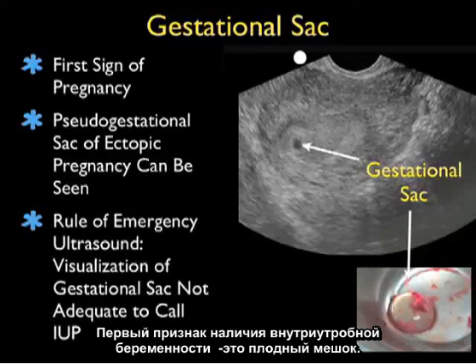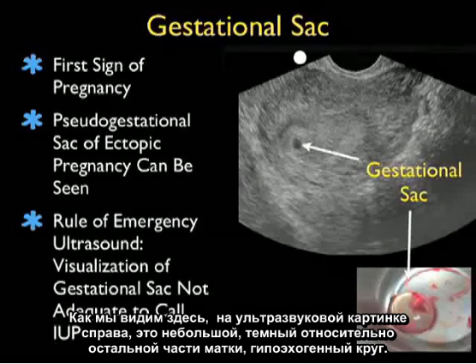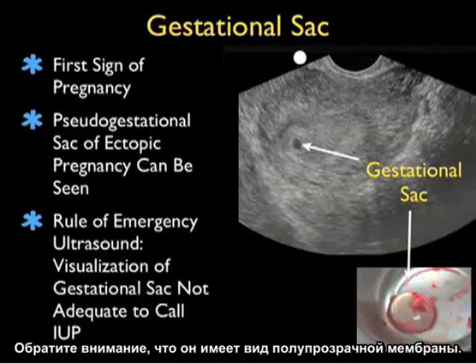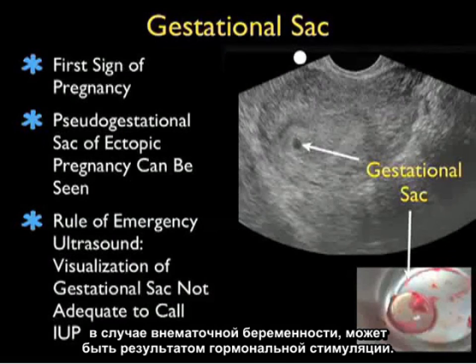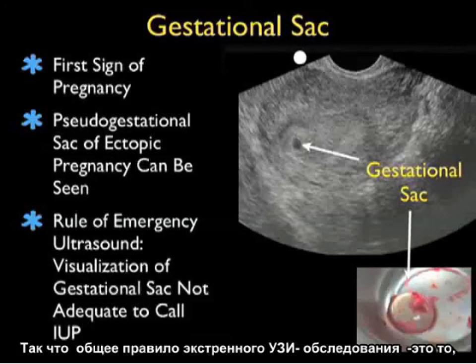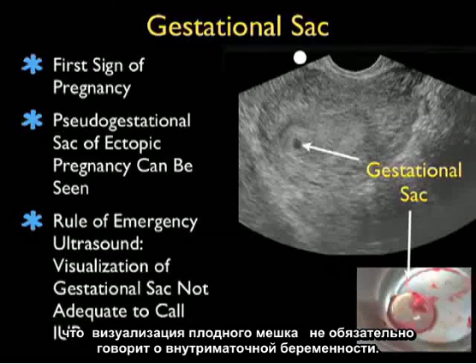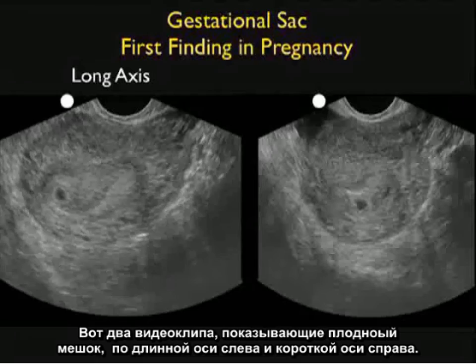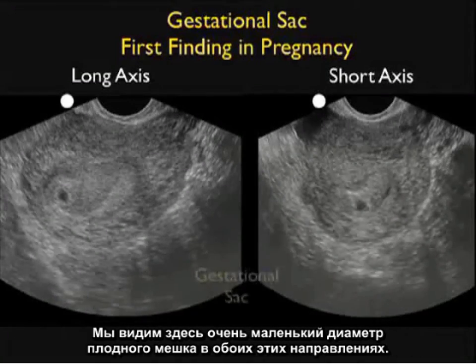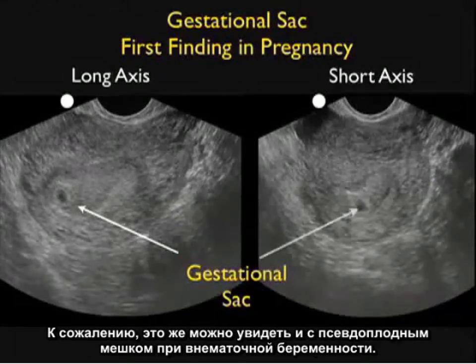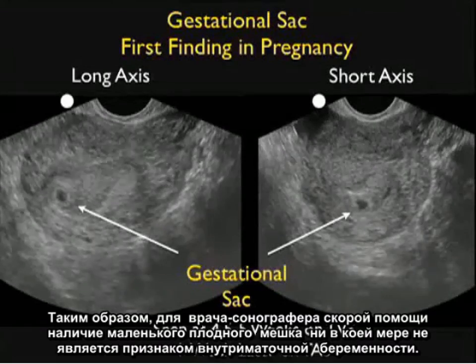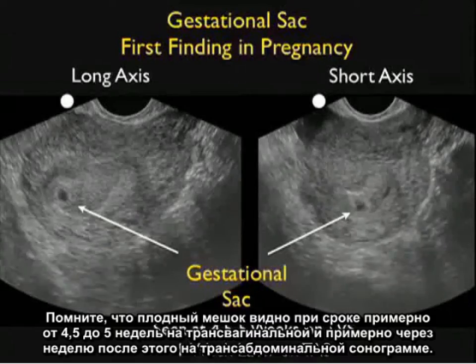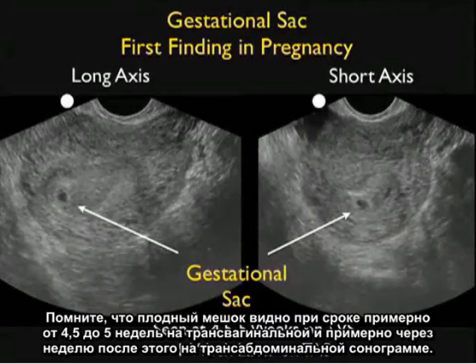The first finding during an intrauterine pregnancy is a gestational sac. As seen in the ultrasound picture, it's a small round dark or hypoechoic circle relative to the rest of the uterus. Unfortunately, the gestational sac alone is not diagnostic of an intrauterine pregnancy, as a pseudo-gestational sac of ectopic pregnancy can be seen from hormonal stimulation. These video clips show the gestational sac in long axis and short axis — a very small diameter sac that can also be seen with a pseudo-gestational sac of ectopic pregnancy. The gestational sac is seen at about 4.5 to 5 weeks on transvaginal sonography and about a week later on transabdominal sonography.